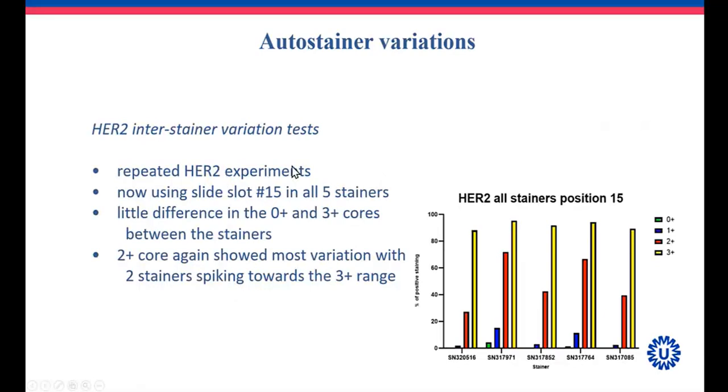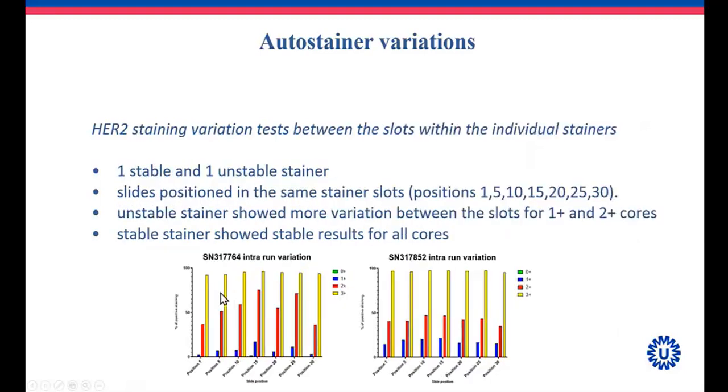So we repeated the HER2 experiments, and for all the 5 machines that we have in use, we used the same slot in all the different stainers, slot number 15, again to reduce variation. And when we depicted the results, what you can see on the bottom right, there was quite a minimal difference for the 0 and the 3+ scores between the different stainers, but you can see that the red, the 2+ bars, show quite some variation, which goes from like 25 perhaps up to like 75, and that was way too much. And 2 of the stainers were even spiking towards the 3+ range.